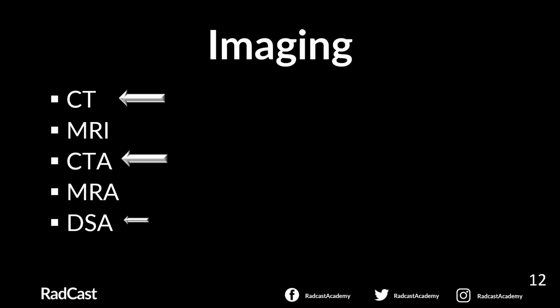What about MRI angiography? It is less available and it takes longer time, so it is unsuitable, specifically when patients are unstable. Digital subtraction angiography is an invasive technique as they will use a catheter to enter inside the vessels. Even though it is invasive, it is better to delineate small vessels.